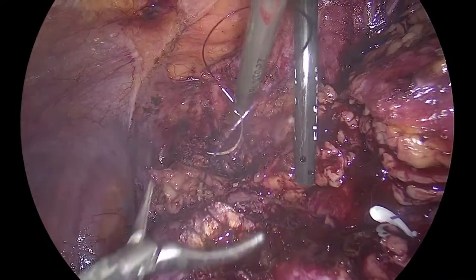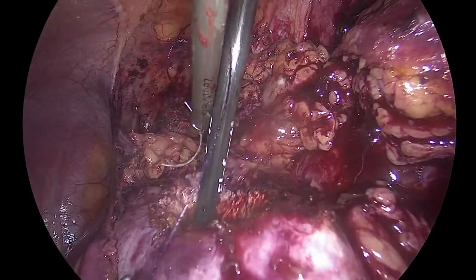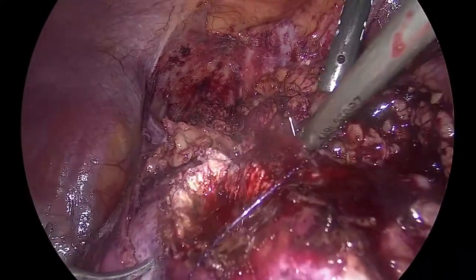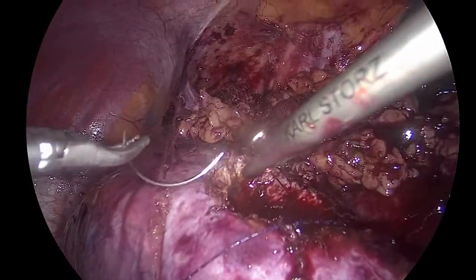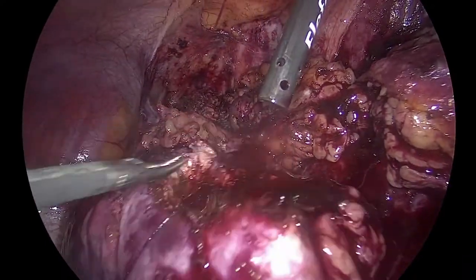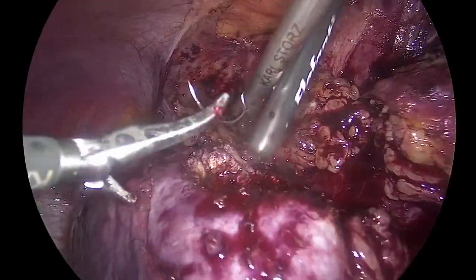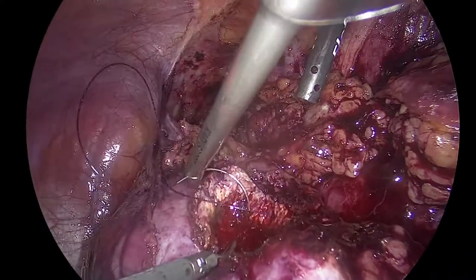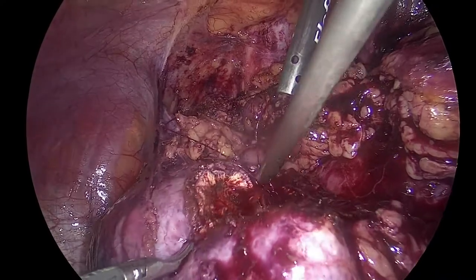Aspirate inside for me, please. Inside. Good. Okay. Go. Give me a correct orientation, huh? Correct orientation, that's what I want. Good, come in. You always use the barbed suture for the inner layer? I like the barbed suture. I know a lot of people don't like it. I kind of like it.